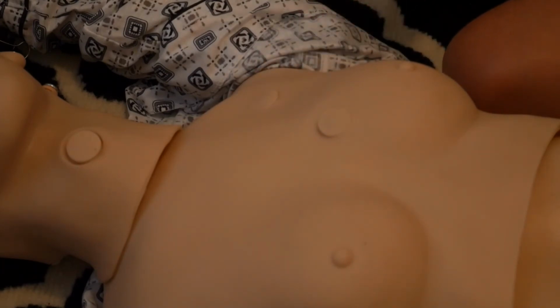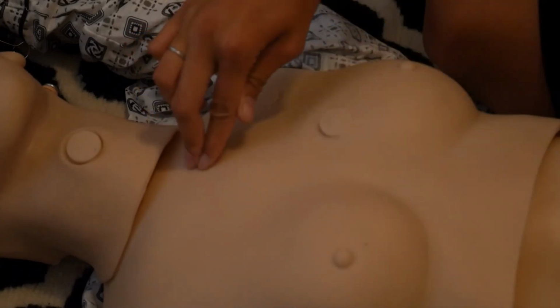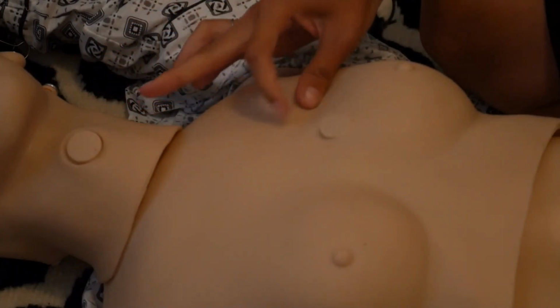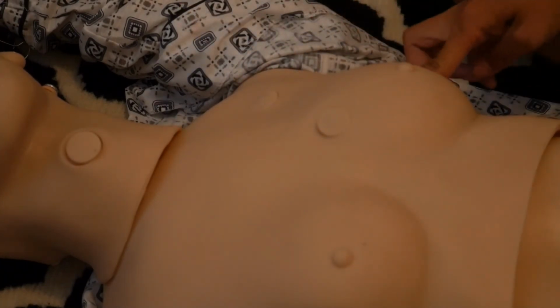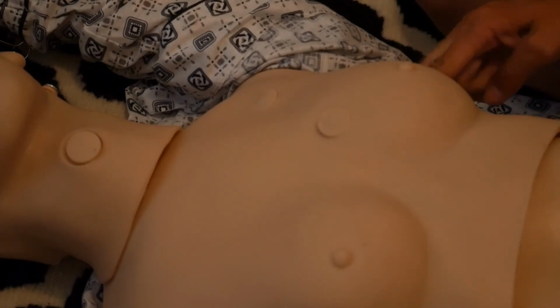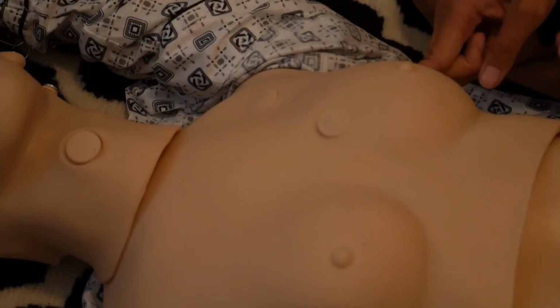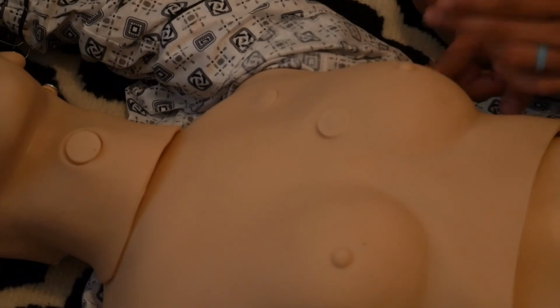Okay, so I'm going to go ahead and try one of the other sites. I'm going to go to the clavicle and find the first intercostal space, the second, the third, fourth, go down, fifth, and I'm going to be at the anterior axillary line, just lateral to the nipple. So basically what that's saying is I'm not going to be at the mid-axillary line. I'm going to be at the front of the body, more at the front, to the right of the nipple, because lateral means away from the middle.